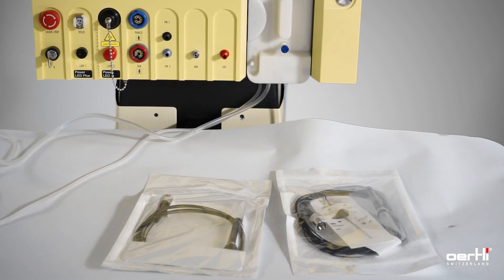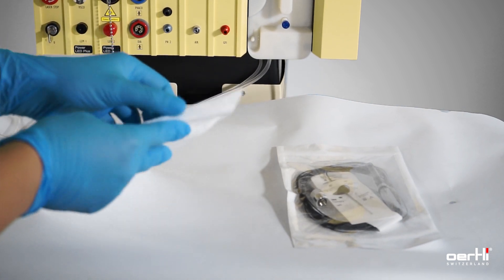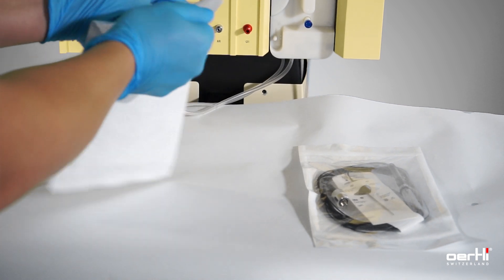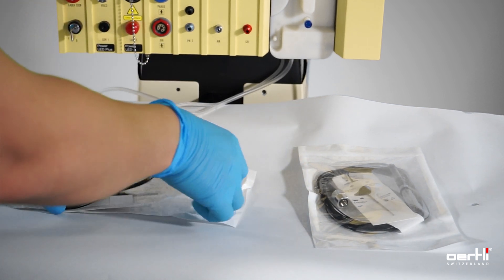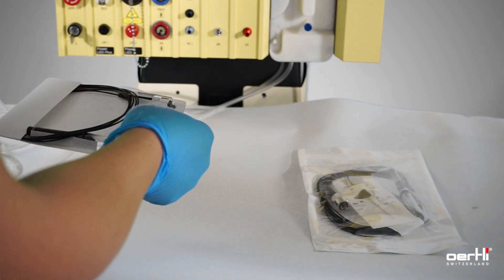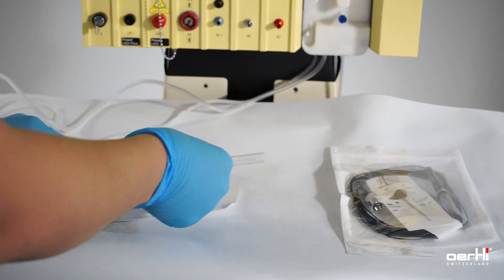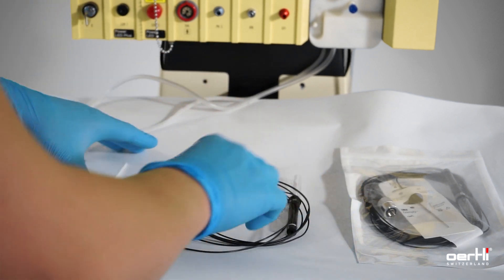We start with the laser hand probe. Open the bag. Remove the instruments from its plate and be gentle and careful with the fiber.